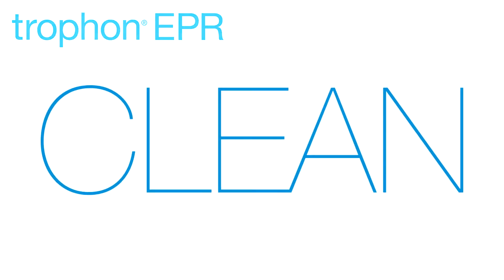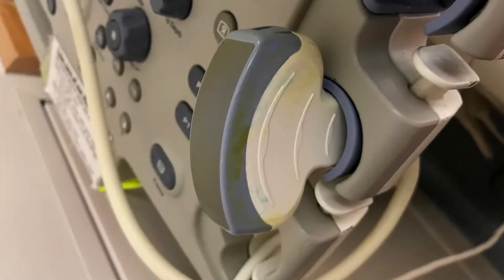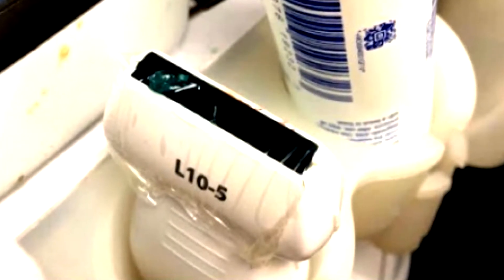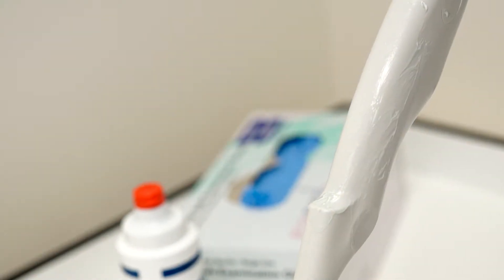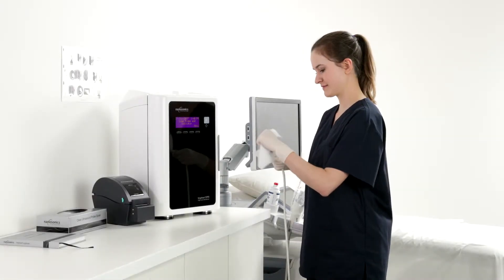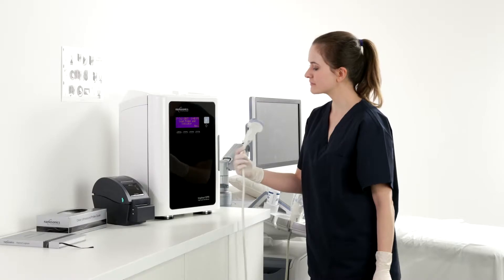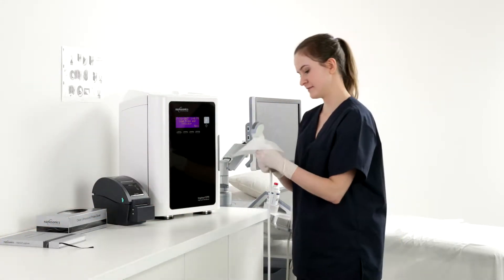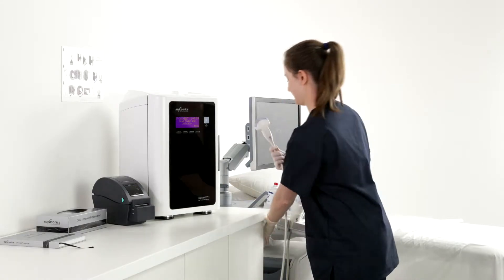Clean. Cleaning is the essential first step in reprocessing ultrasound probes. It is the key to the reduction of organic material, microbial load, gel, and other soils on the surface of the ultrasound probes. Before loading the ultrasound probe into TROPHON for high-level disinfection, make sure your ultrasound probe is clean. Use the cleaning wipe to start cleaning the probe from the cable strain relief, moving the wipe up to the top of the probe. Visually inspect the probe and repeat the process if needed until the probe is visibly clean. Use a drying wipe to ensure the probe is completely dry before it is loaded into the TROPHON for high-level disinfection.